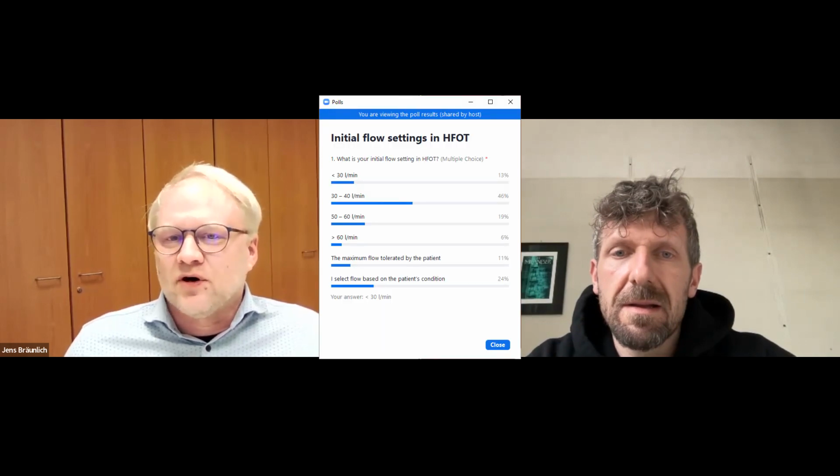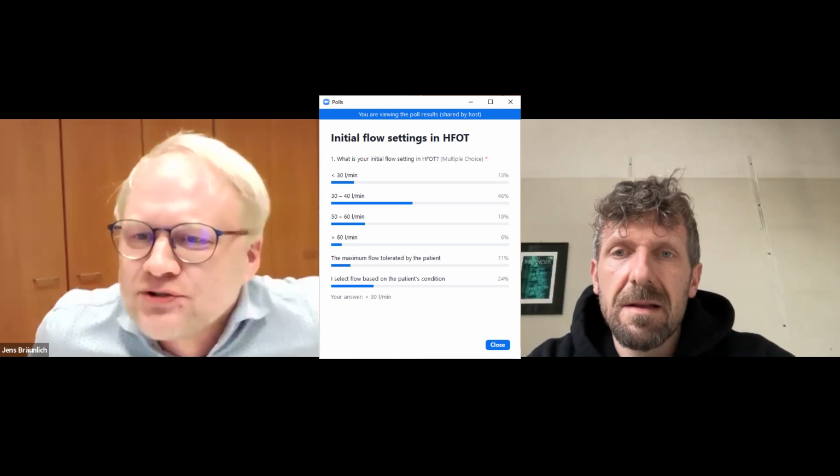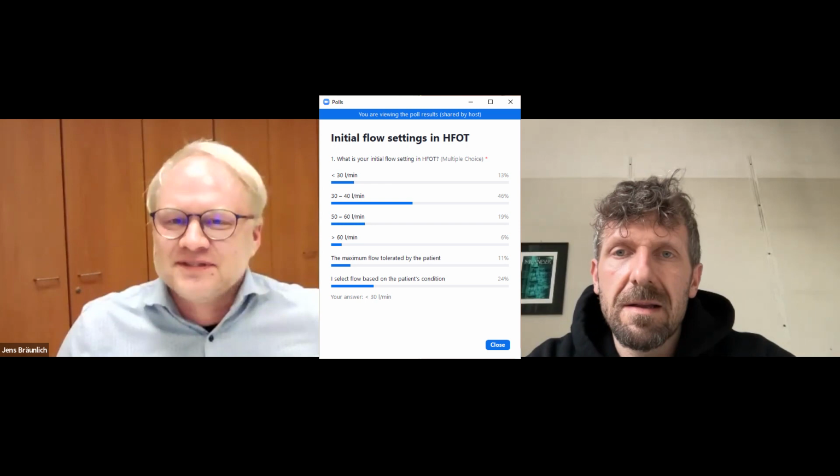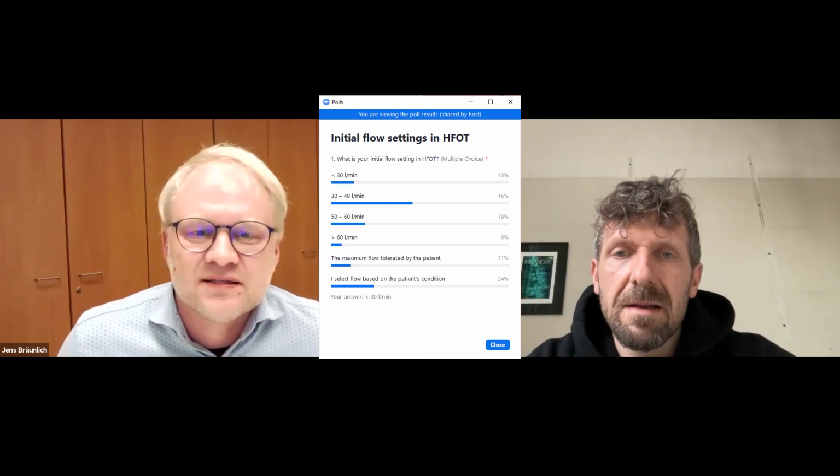And the most points, I think we can say, came to 30 or 40 liters per minute. And the second place goes to, these are not Olympic Games, 50 and 60 liters per minute. Okay, thank you. A lot of heterogeneity, a lot of differences. This means that there is no consensus on how to select settings, exactly what we speak about today.